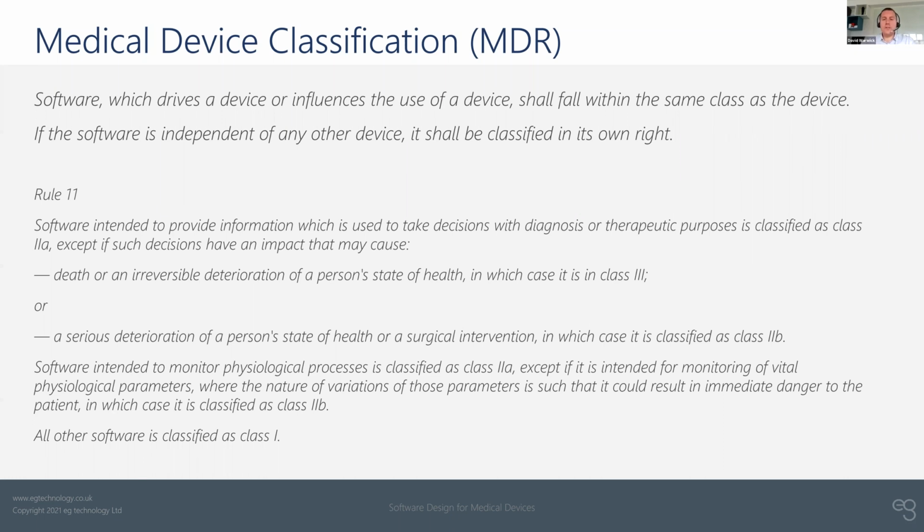There's wording in the guidance these days which talks about directly driving a clinical decision, and in your case it sounds like that is probably not going to be the case. It is indeed, as you're intending, supportive information. Thank you so much.